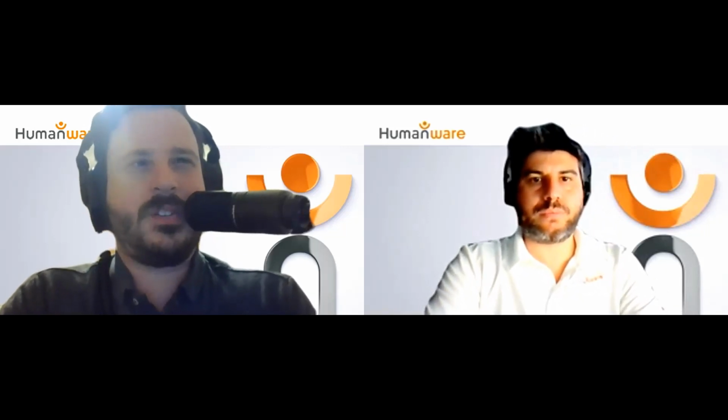Now, another piece of this, and again, we've talked about JAWS, we're going to talk about NVDA in addition to VoiceOver. And NVDA is something I use a lot, depending. All of us have multiple tools in our toolbox. I talk about this all the time. There's no one-size-fits-all solution, much like you might not be stuck using one web browser or one piece of technology. You're definitely going to want to use, or at least be familiar with, multiple screen readers.